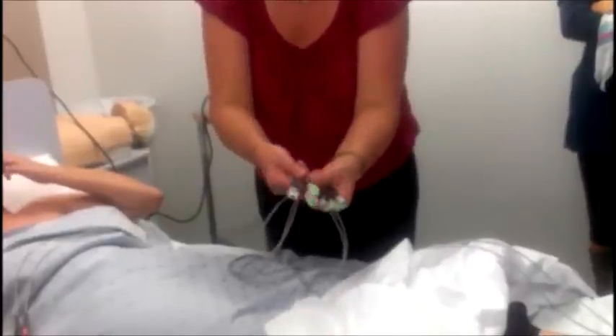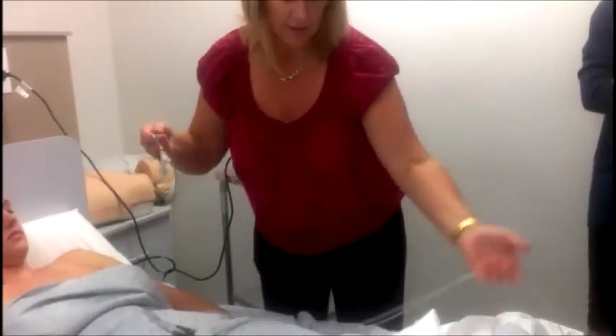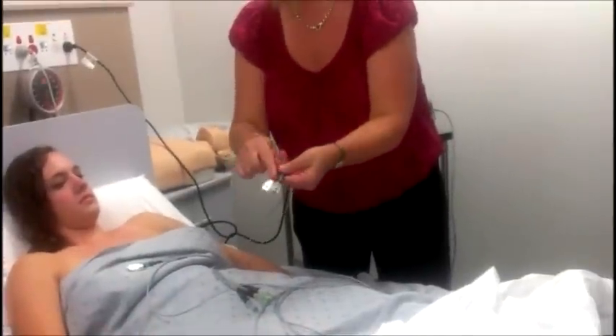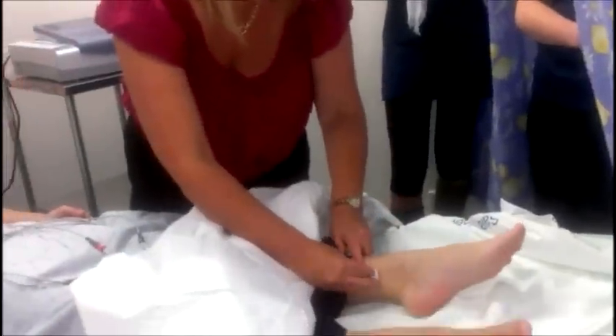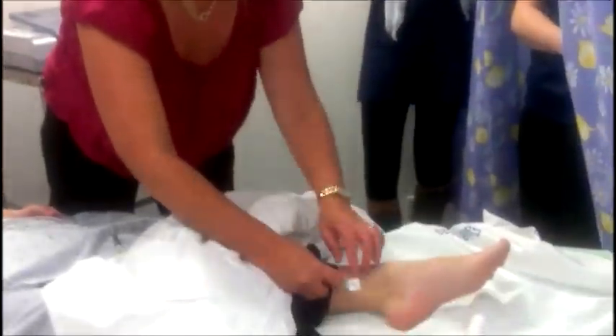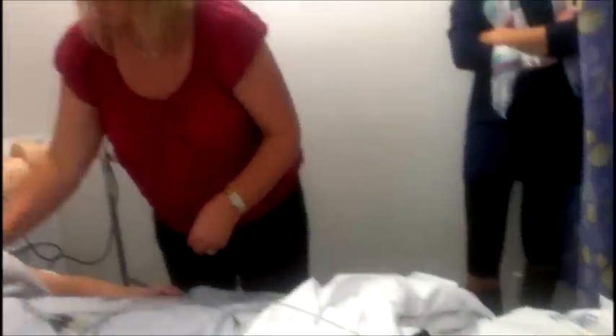They're all marked with their different numbers. So that's the side one and the central one. It says left leg, left arm. We don't put them on bony prominences — just on the inside is fine. If you can't put them on the limbs, you can put them down on the torso and up on the shoulders, but you don't get as good a reading, so use the limbs if you can. With these clips, the clip comes up, you slide it on and clip it in place. Make sure you don't clip the patient's skin.